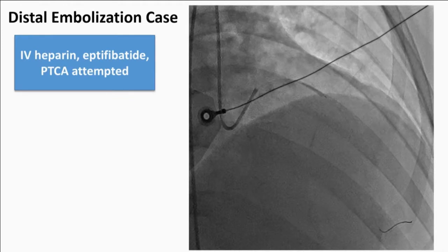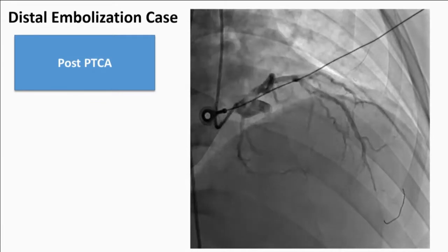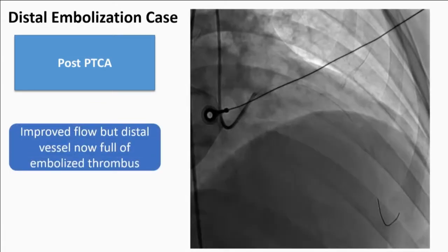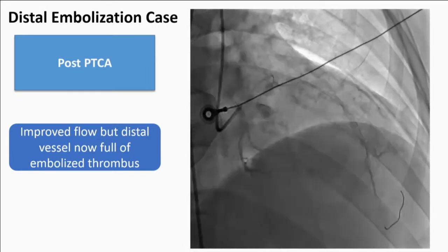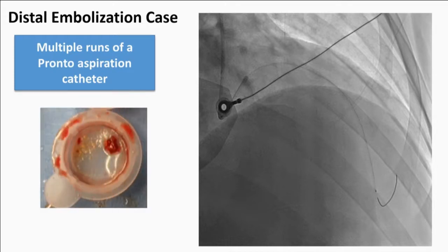The typical treatment we would administer to a heavy thrombotic lesion: IV heparin, eptifibatide, PTCA attempted. Post-angioplasty, you can see restoration of some flow. However, the distal vessel is now not filling and is likely full of thrombus. Multiple runs of an aspiration catheter were performed and some thrombin-rich clot was removed.